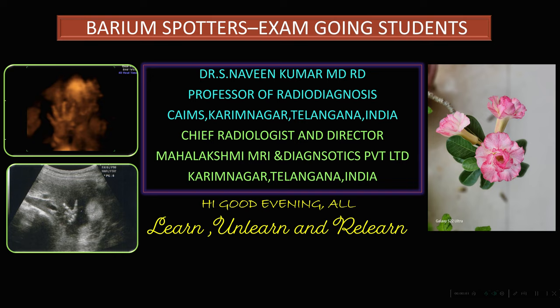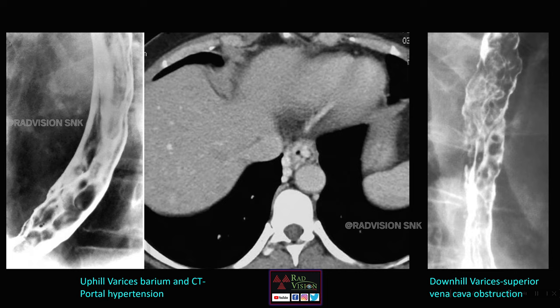Good evening all, welcome to the new session. We will try to see some important barium spotters which are very useful for exam-going students. Coming to the first case, you can see there are multiple serpiginous filling defects noted in the lower one-third of the esophagus. Whenever you see these types of multiple serpiginous or lobular filling defects in the lower one-third of the esophagus, suspect uphill varices.